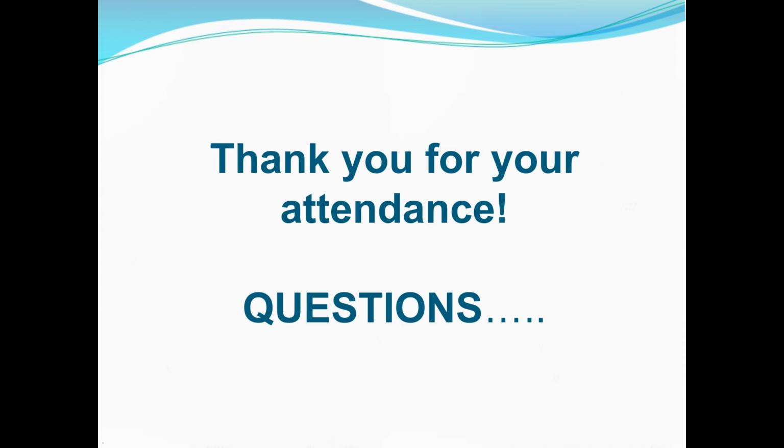All right, thank you. Next question is, how do you transfer the pellet from the microcentrifuge tube to the MALDI target? So there's a couple of different ways you can do it. We usually just use the toothpick that we would use to spot with the regular organism. Sometimes if it's really liquidy, then we'll just use that 1 microliter pipette that we would use for putting the matrix on it. So we do it either way. We can use the toothpick or we can use the 1 microliter pipette.